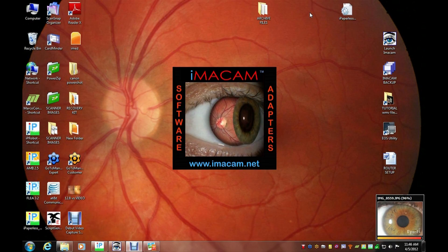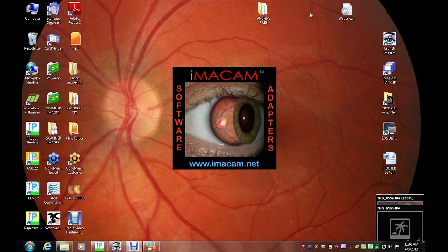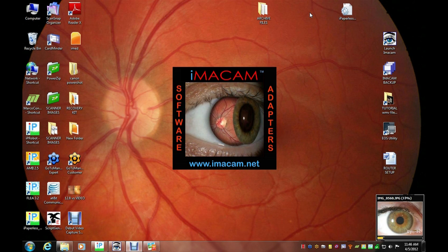As images are captured and transferred, they appear on the PC monitor as thumbnails.